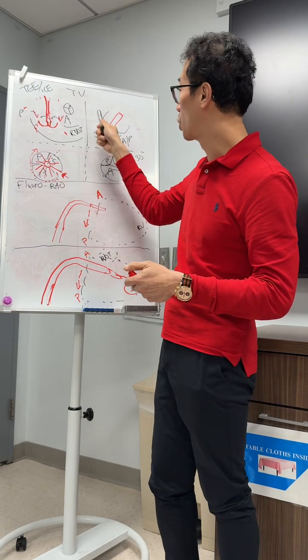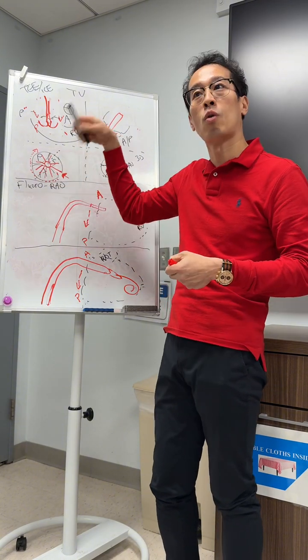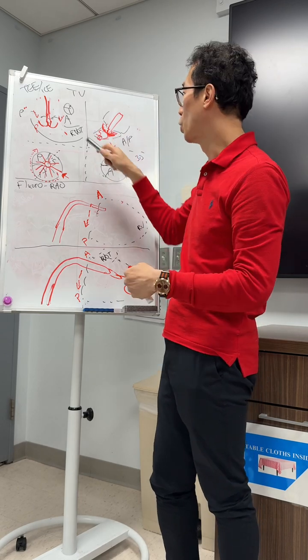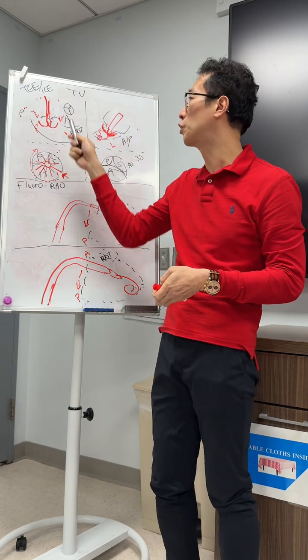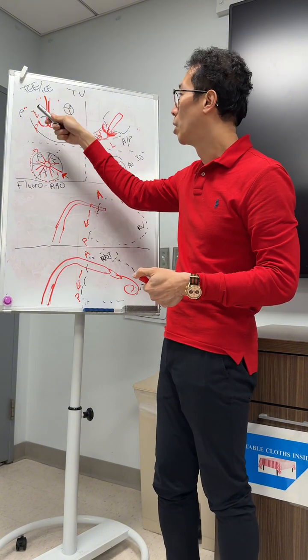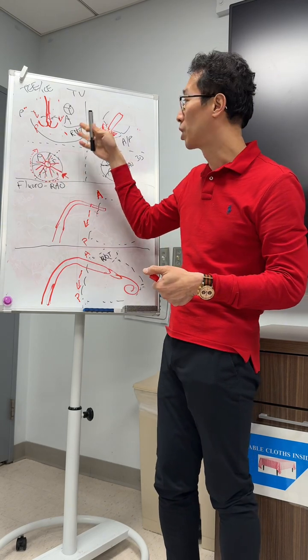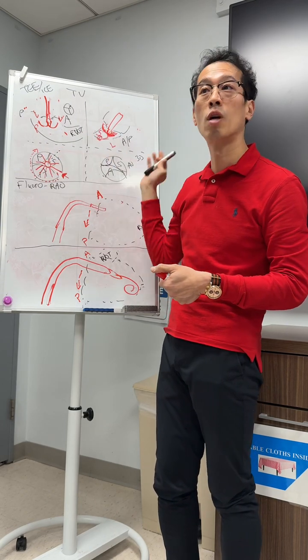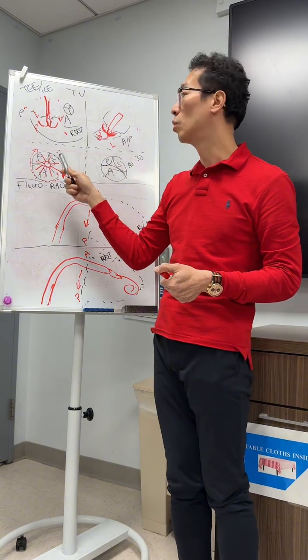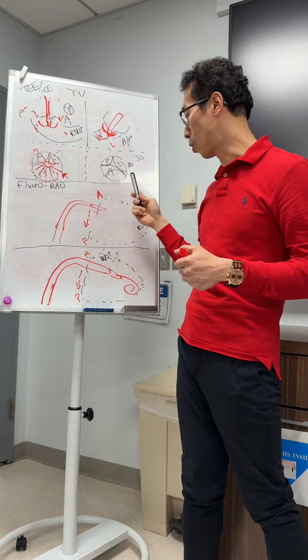So I'm also looking at this side at the same time. Maybe when you spin it, I can't see this side, but before I could, because everything is perpendicular. So you actually have 4 quadrants to look at. Obviously, you focus on one because you're doing the rotation. But if you have trouble imaging other parts by the time you do your spin, maybe because you're off center, you can actually use that to your advantage. So that's the trick to confirm leaflet capture for a leaflet capture TTVR device like Evoque.